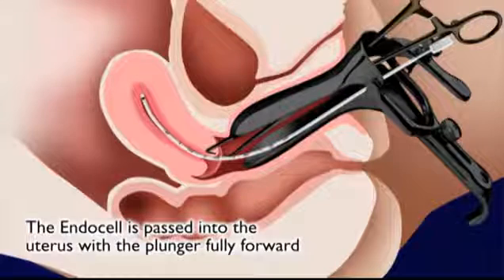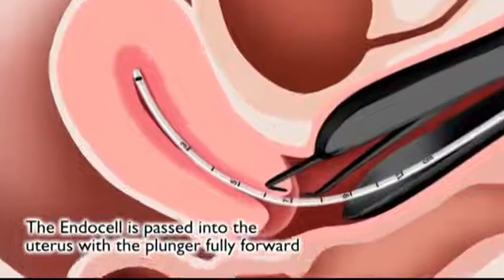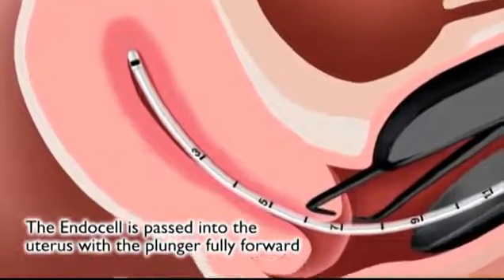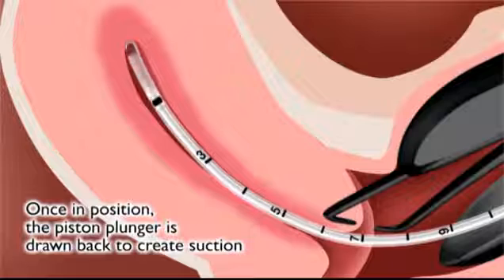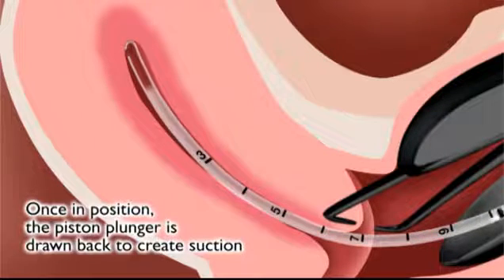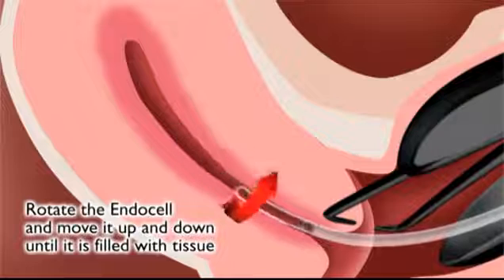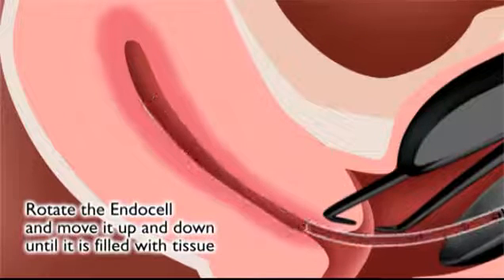The average uterine length is 6 to 8 centimeters. The piston plunger must remain fully forward in the sheath during placement. Once in position, the piston plunger is drawn back to create suction. It should be rotated and moved up and down in the uterus so it can suction an adequate sample of endometrial tissue.